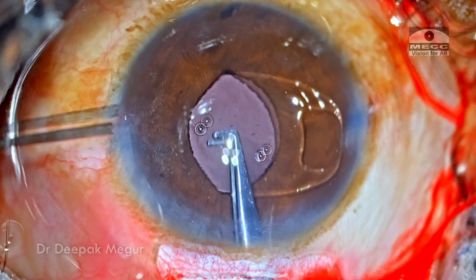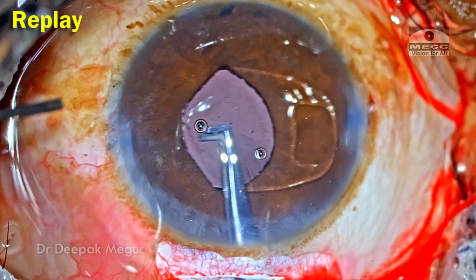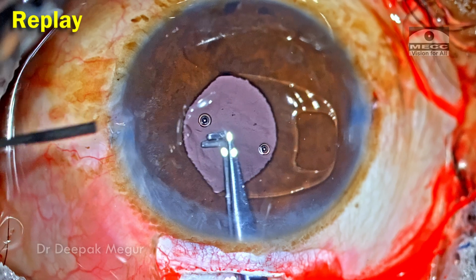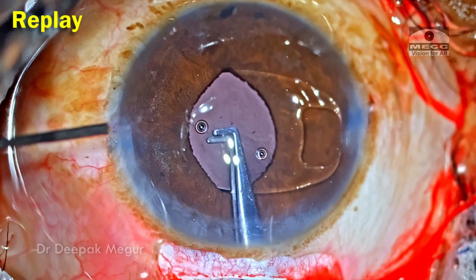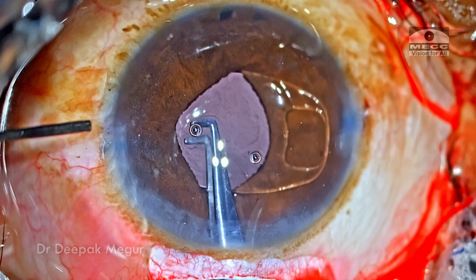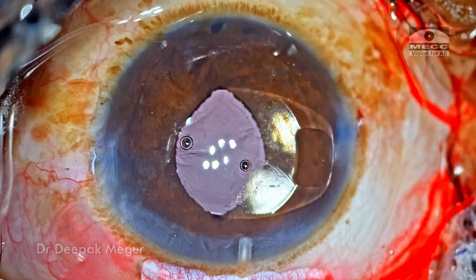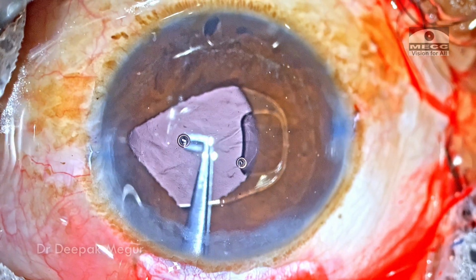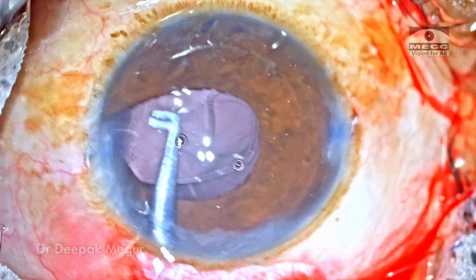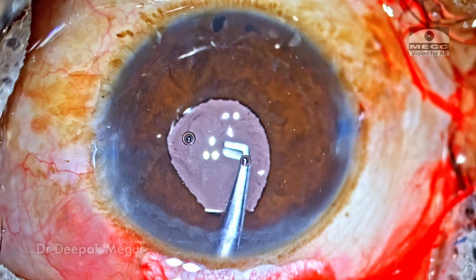And before leaving, just to ensure that the enclavation is foolproof, I just move the iris claw lens away so that I can see that the iris which is tucked in also is moving along with the lens. This ensures that the enclavation is good enough. The forceps is withdrawn, the chamber is again repressurized with OVD, the hands are switched. Now using my left hand to hold the lens, and I'll be using the right hand to enclavate using the same 26G hydrodissection cannula.